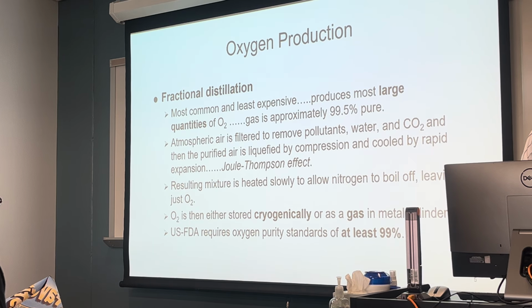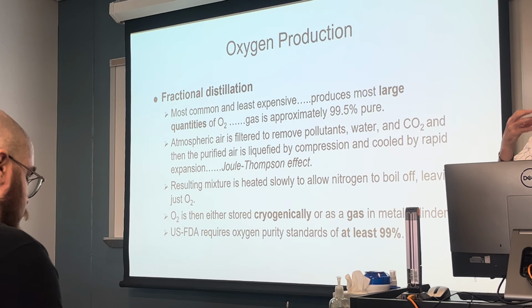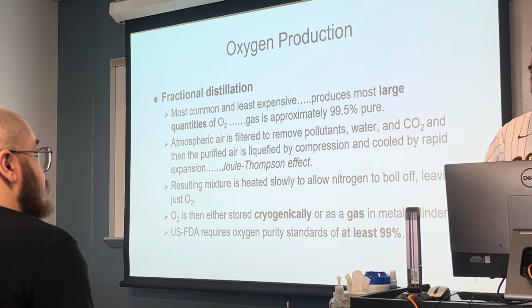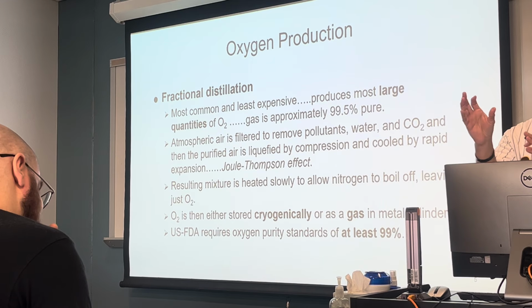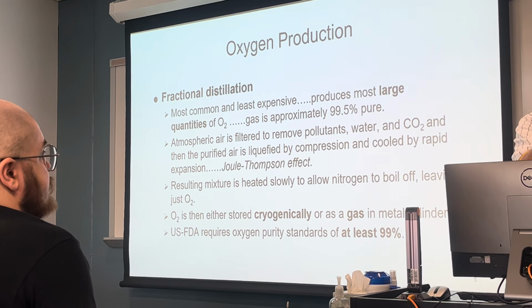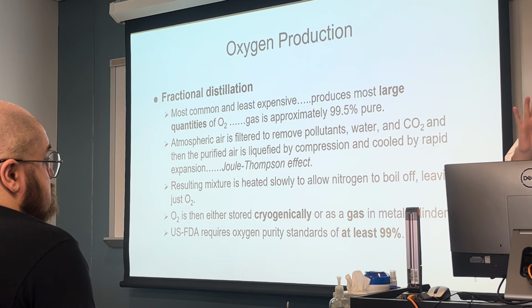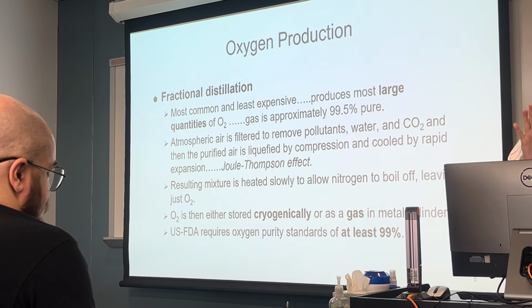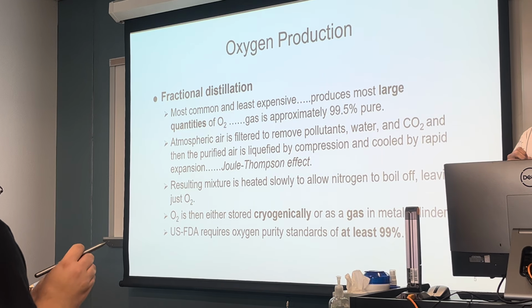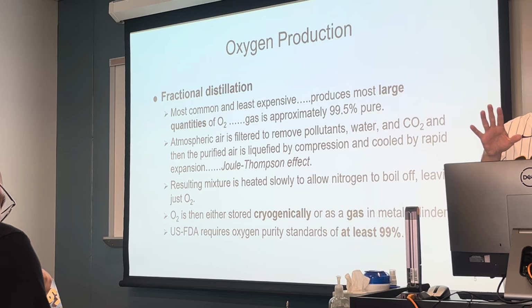We'll get into some of this a little bit later, but I will just give you a helpful hint. Liquid oxygen, when it is stored cryogenically, is not frozen, and I know we just used the term frozen. It's not a block of ice; it still remains a liquid, oxygen as a liquid. The temperature is negative 181 degrees Fahrenheit. Would you agree that's pretty cold? Yes, that is pretty cold. Negative 181 degrees Fahrenheit, or something like negative 118 degrees Celsius.